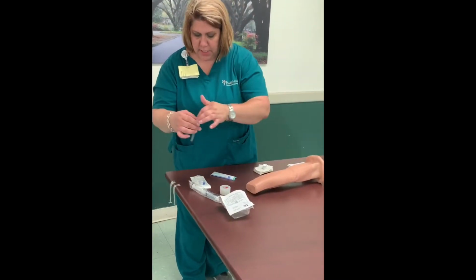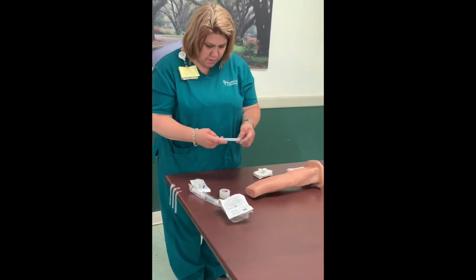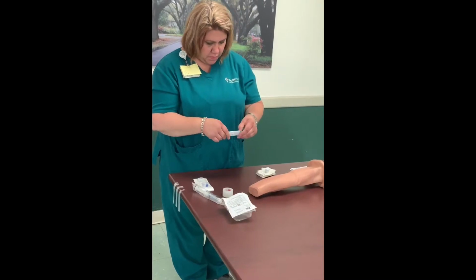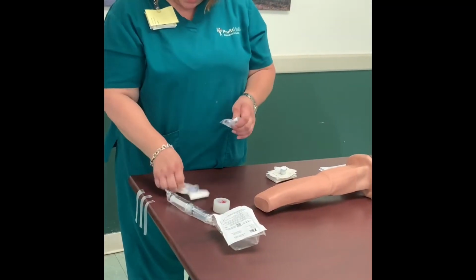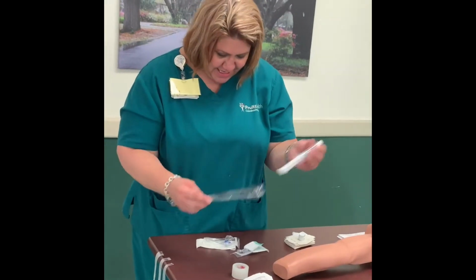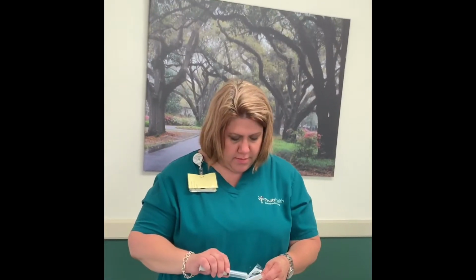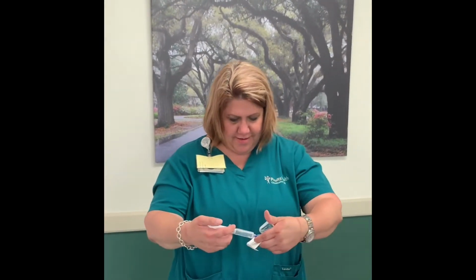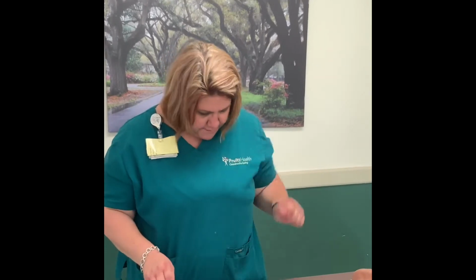Stick it down on the table. I'm going to go ahead and open my catheter and then my extension tubing. So here's my flush. I'm going to make sure it flushes. All right, so that flushes just fine. I'm going to leave that just like that.